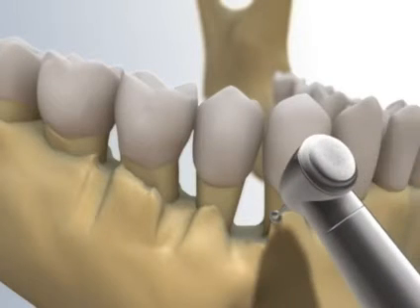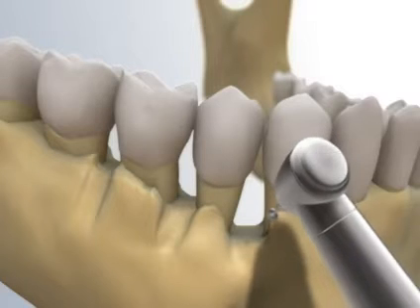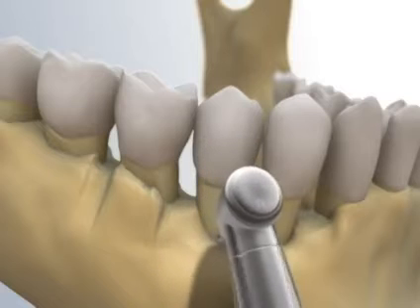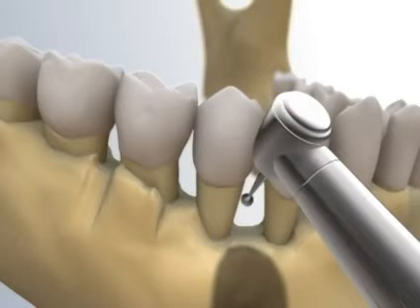With a long-shanked carbide burr or a number 4 diamond high-speed surgical burr under sterile saline irrigation and hand instruments such as bone chisels and curettes, the buccal and lingual marginal bone on teeth 4-4 and 4-5 is carefully removed. Caution must be exercised in order not to remove excess bone. After the bone removal, positive architecture is achieved. The interproximal bone between teeth 4-4 and 4-5 is more coronal than the marginal bones.